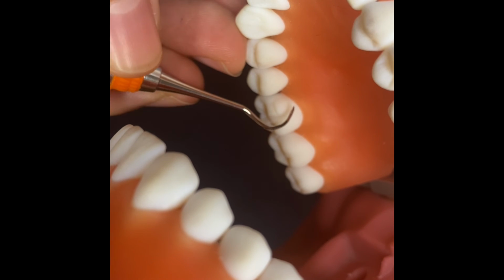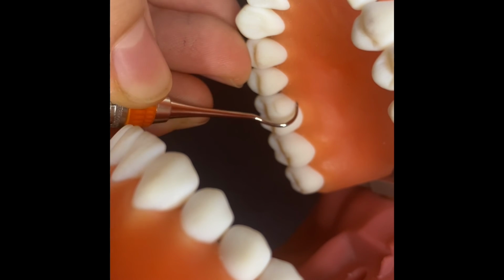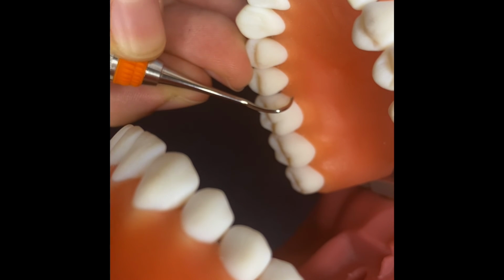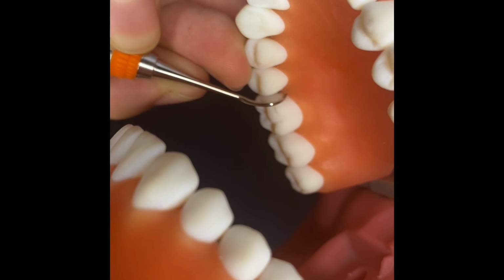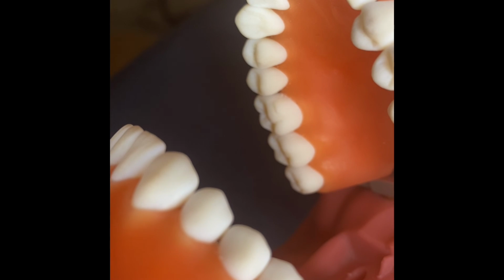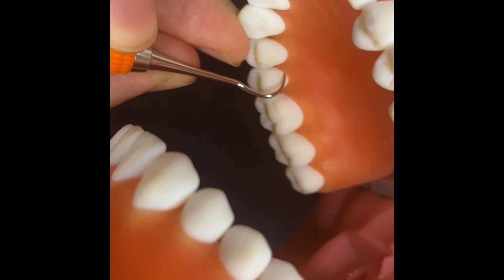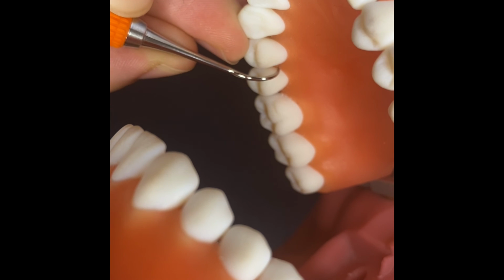Now towards the mesial, side to side, pivot, roll, side to side, pivot, roll, up, down, up, down.